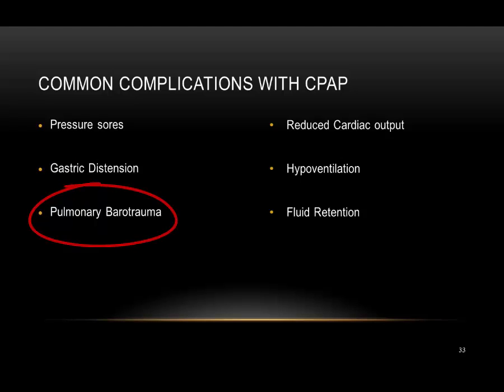Pulmonary barotrauma. With mask CPAP, as with any positive pressure airway therapy, the potential for distension and pulmonary barotrauma is always present. However, in an investigation cited by Branson in 1985, only 1 of 196 patients developed evidence of barotrauma, which was a pneumomediastinum, representing a complication rate of 0.5%. The low incidence of barotrauma in these patients may be attributed to the use of spontaneous breathing as the method of ventilatory support. To further minimize this risk, the status of the patient's lung diseases should be considered when prescribing CPAP.